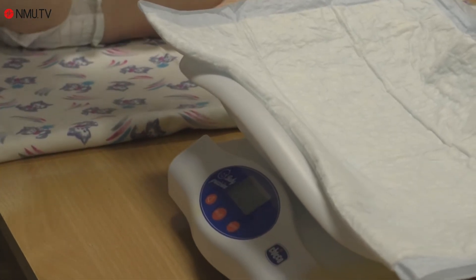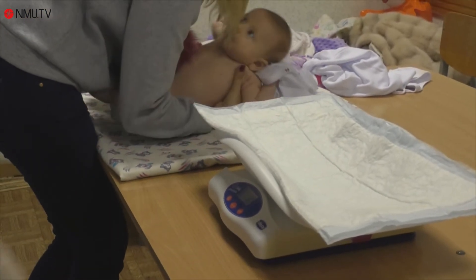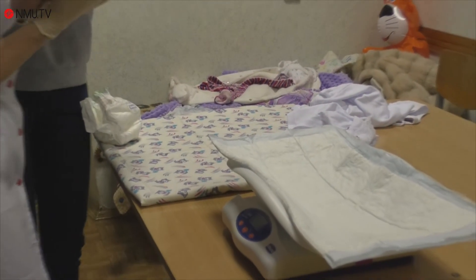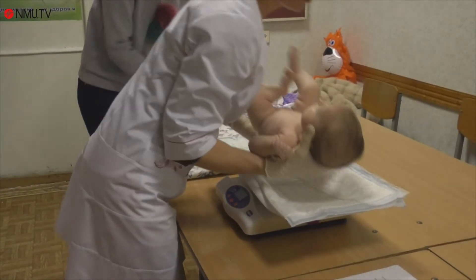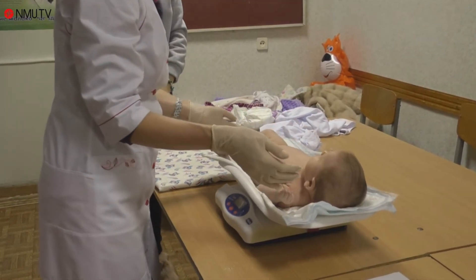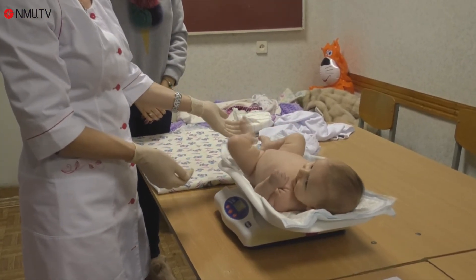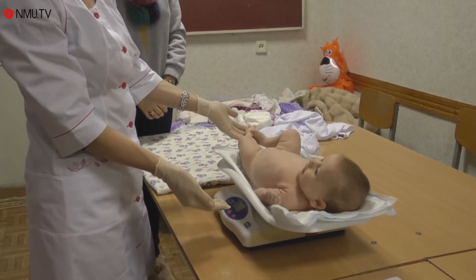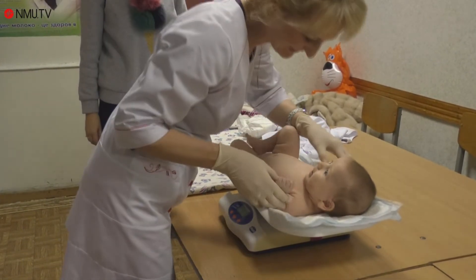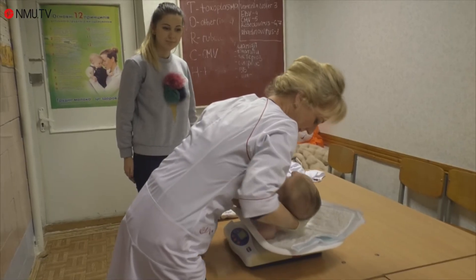We are waiting for the reset of the scale, then we can start to measure. We put the child in the middle of the scale pan. Make sure that the hands and legs do not touch the table. The mother does not support the child. We wait until the electronic scoreboard stops flashing and fix the result. Weight is 4 kg 437 g.